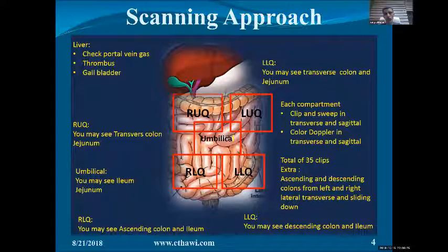So in the liver view, in the right upper quadrant, you have to look at the liver. If you're looking at the bowel, you use the high-frequency hockey stick transducer. But if you're looking at the liver, the deep structure, you will use the curvilinear, low-frequency transducer. Okay? Yes.